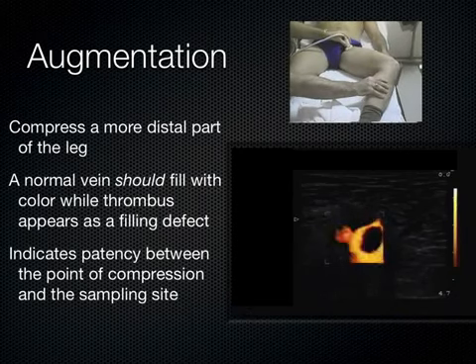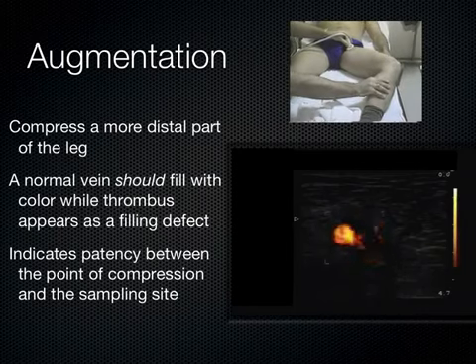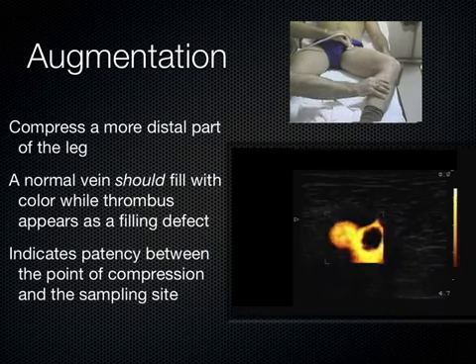You have a patient that you think could have a blood clot in their leg, you can't get the study done, and so what you end up doing is, it's after hours, it's 7 p.m. or it's on the weekends, you end up basically waiting, giving the patient blood thinning agent like Lovenox or heparin, and waiting until the next day when the ultrasound tech comes in to scan the patient.